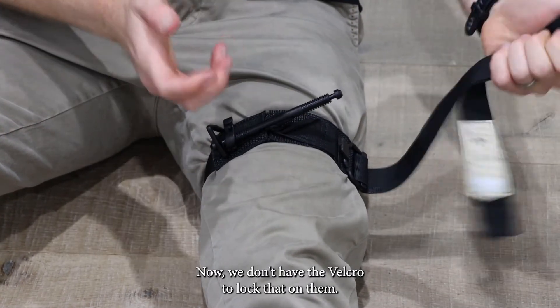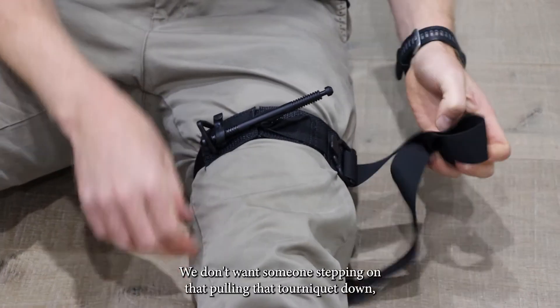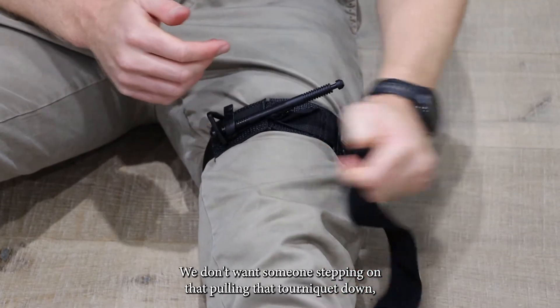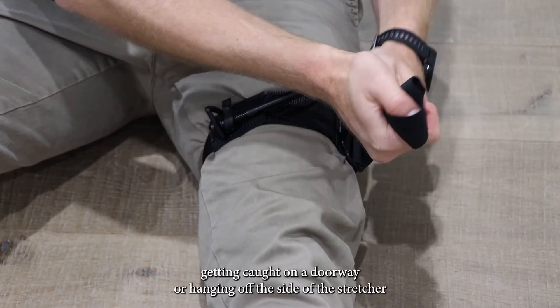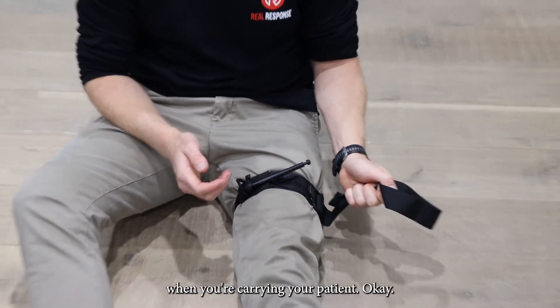Now, we don't have the Velcro to lock that on, so we just want to make sure we tuck all of that in place. We don't want someone stepping on that, pulling that tourniquet down, or getting it caught on a doorway or hanging off the side of a stretcher when carrying your patient.